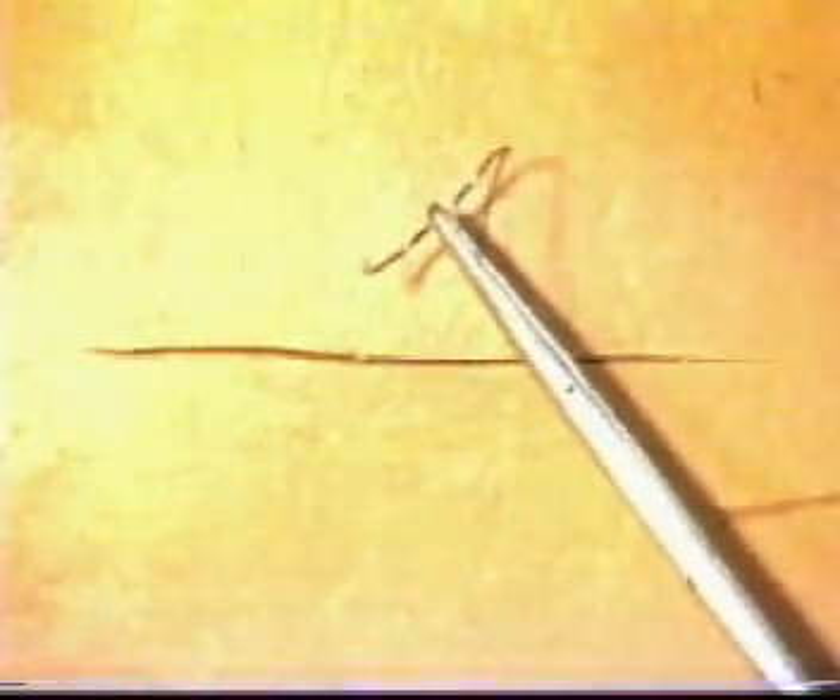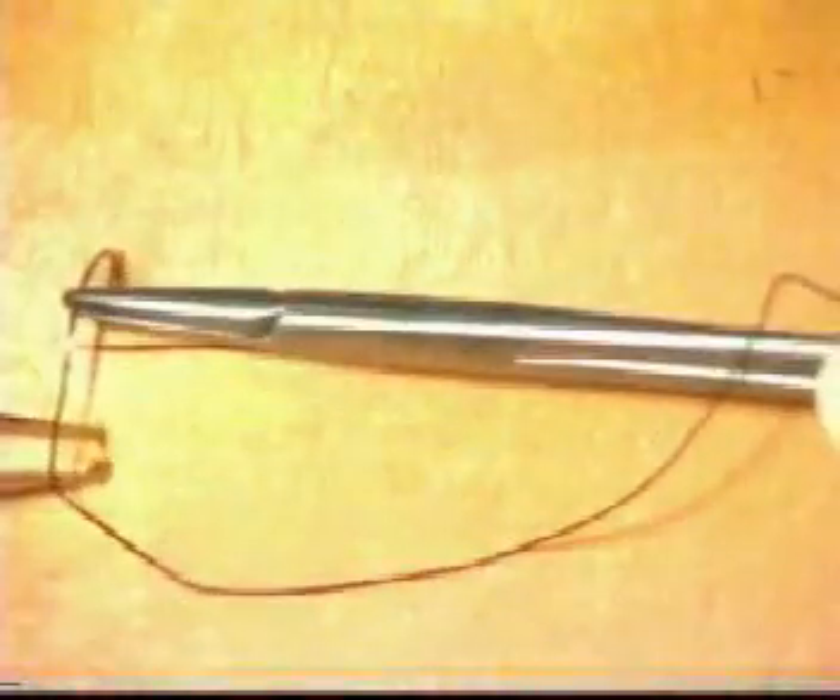Begin by making an incision on the simulated skin pad provided. We will now close this with interrupted sutures. Take a suture in your needle holder and insert the needle at right angles to the incision using counterpressure from the forceps. Pull the suture through gently without snagging it. Secure a standard reef knot, either using the one-handed technique or the instrument technique.